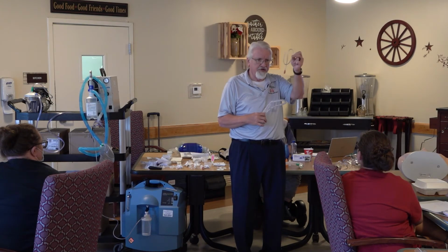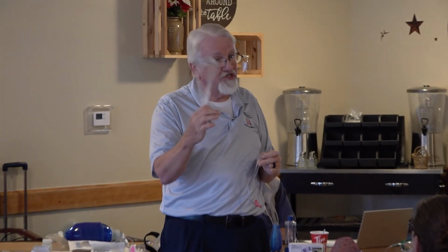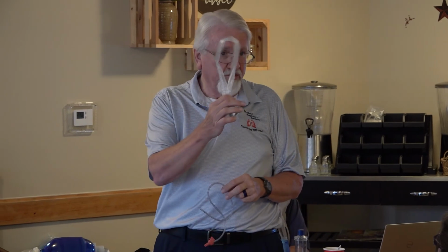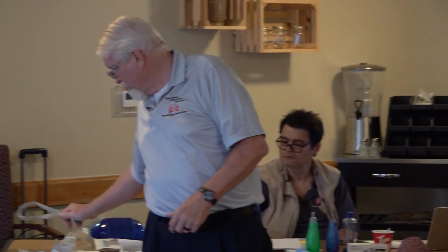So, yeah, I forget, 51 cents or something like that. And so in a box of 100 of these, same price, I get a box of 50 of these. But these are good for 24 hours. So Bob uses 4 or 5 of these. I could have just bought 1. So I think probably you will eventually lean towards these.